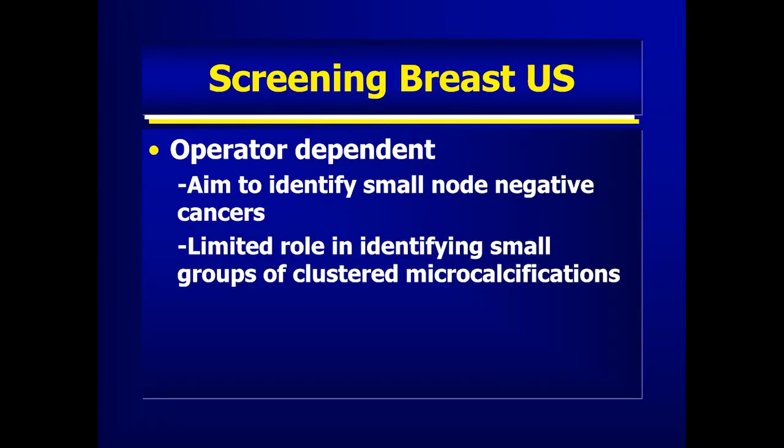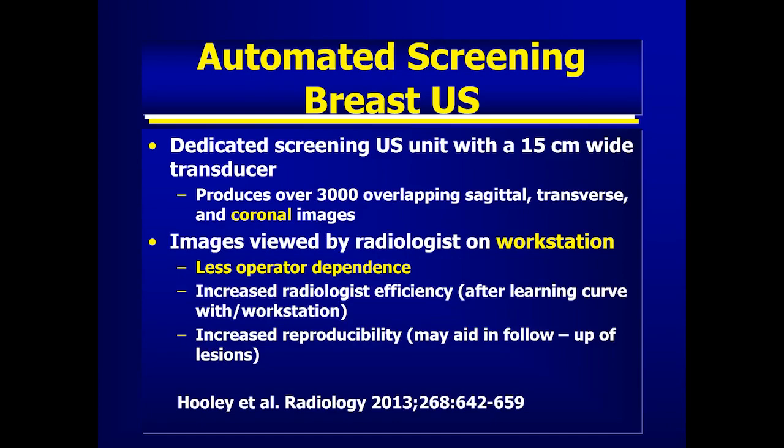Screening breast ultrasound is operator dependent. We would aim to identify small node-negative cancers, and it has a very limited role in identifying small groups of clustered microcalcifications. The identification and the biopsy of calcifications is better handled with mammography and stereotactic biopsy.